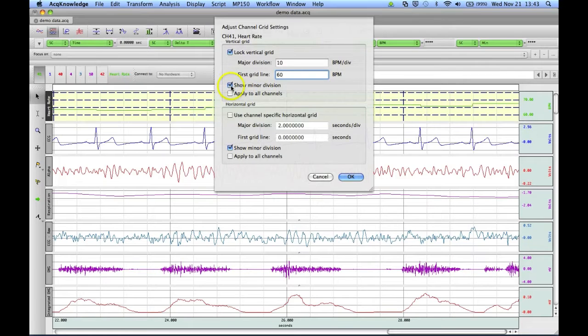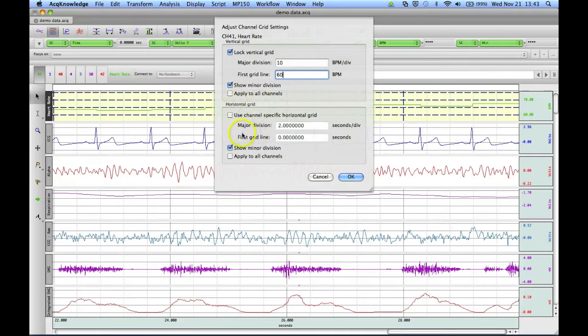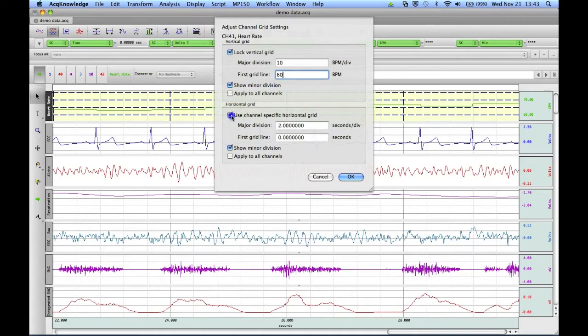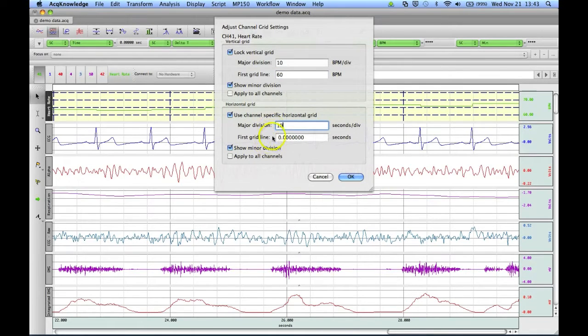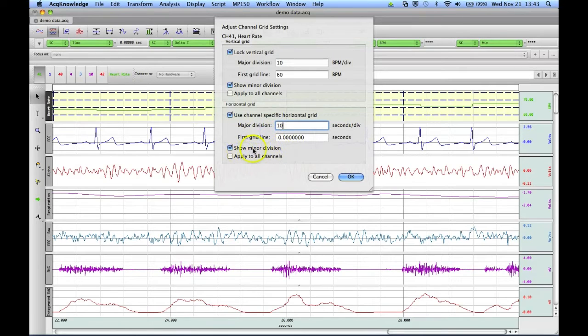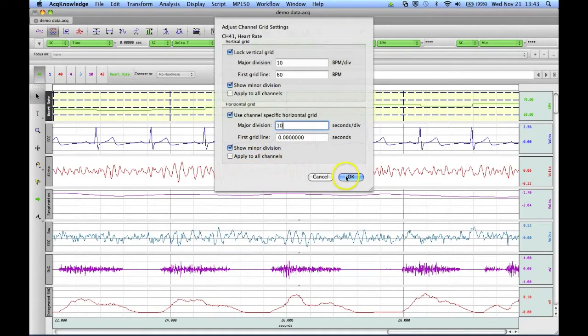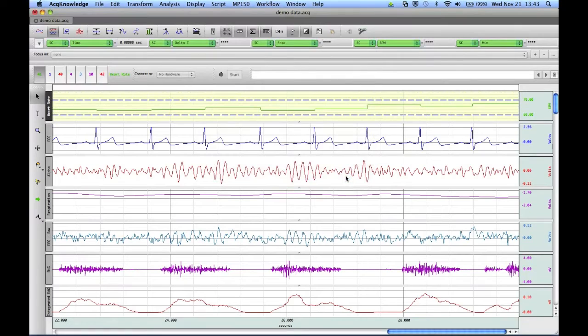We can choose to show or not show our minor divisions. And for the horizontal, we can also do a channel-specific grid. And let's say we want to do every 10 seconds per division, first grid line at 0. And again, I'll choose to show our minor, and I'll click on OK.